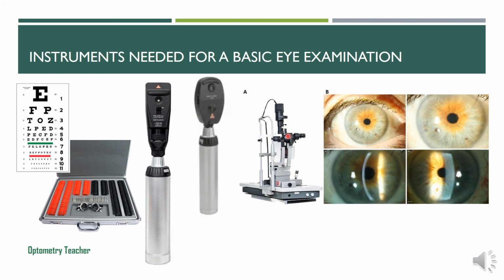And if you can afford it, get a slit lamp. You do not really have to pay so much for a slit lamp. You can get slit lamps in so many different ranges available in the market, but when you're considering an optometry practice, you really need to have a slit lamp as well, so that you can make all your eye examinations perfect.